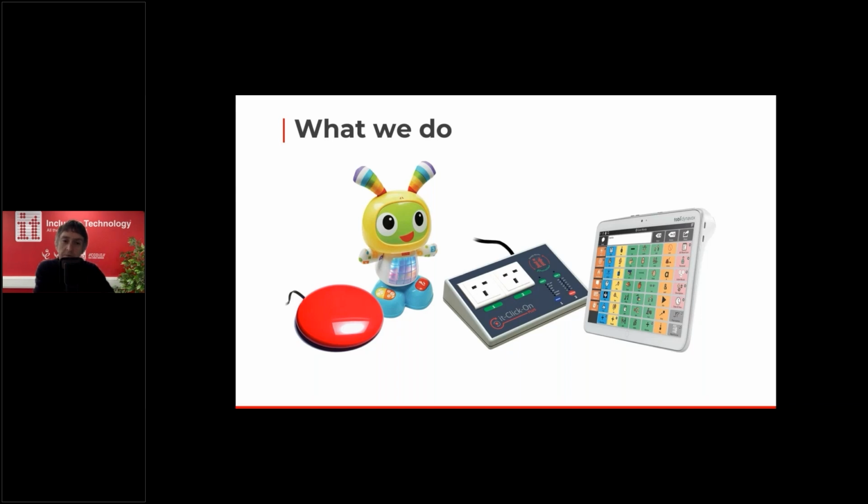And just an example of the kind of benefits and the kind of products that we offer to our users, I've put together a quick compilation video of our users in action, accessing these types of products. I'll show you now.